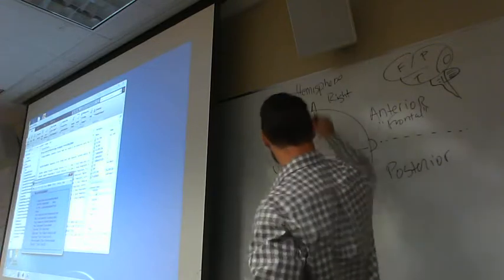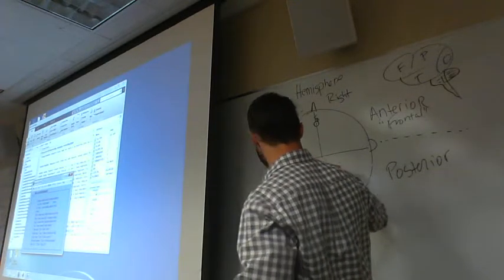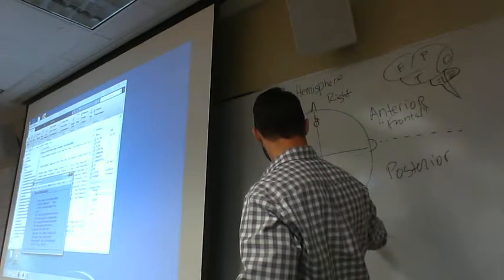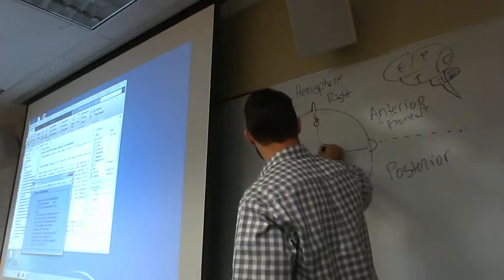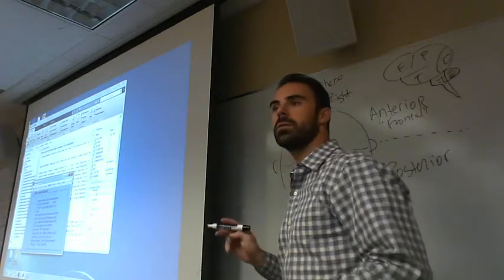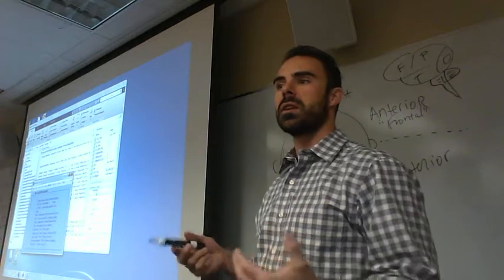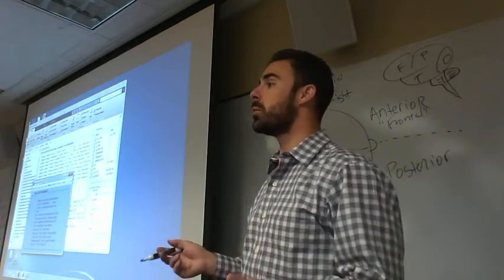So we have our frontal site. Let's say you have a parietal electrode here. That would be PZ. We can come back here and look at one here that would be OZ for occipital. And right here you might have one that could be CZ because it's central, in our central line. So there's ways that we can categorize and classify these different areas of the scalp. All right, let's break it down in a little bit more specificity.